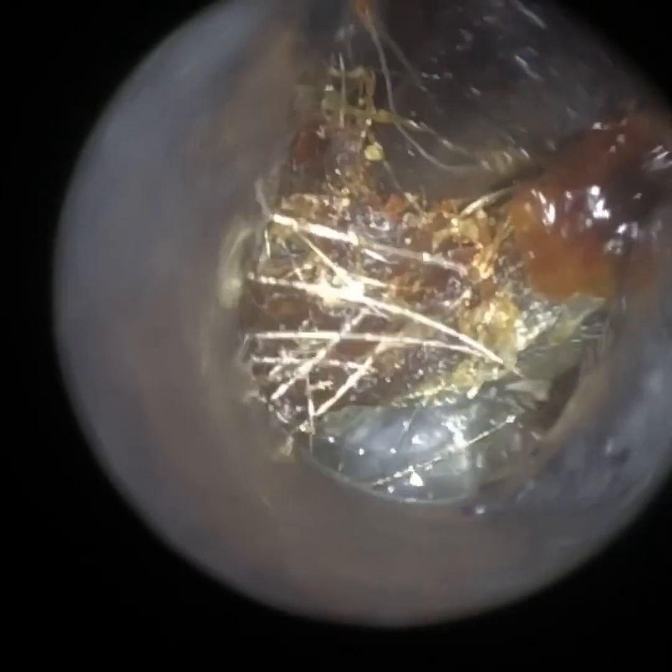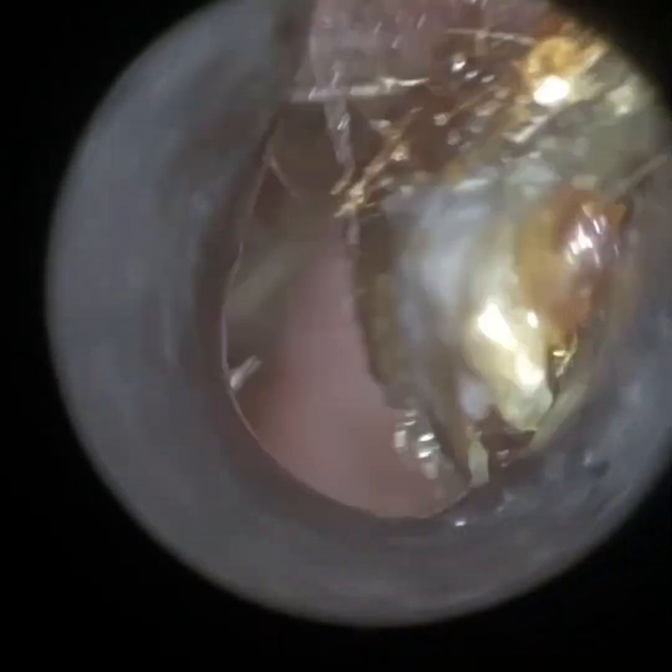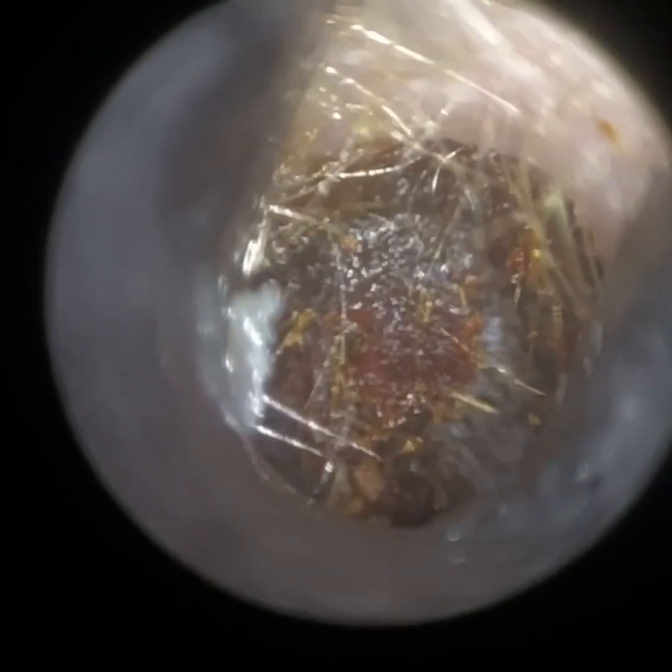Going back to the end of the procedure — you'll see that the patient's got a very, very narrow isthmus, which is a natural narrowing in most of our ear canals, about half a centimetre away from the eardrum. The ear canal widens again and that creates two recesses: inferiorly at the base of the ear canal near the eardrum, and anteriorly at the front part of the eardrum — a little alcove there. When you've got a very bendy ear canal like this, it's near impossible with an ENT microscope, the Waxscope, or even an otoscope to visualise into that gap. That's where an endoscope is in a league of its own — it can peer through little cracks and crevices, blind spots that are blind to a microscope and otoscope.